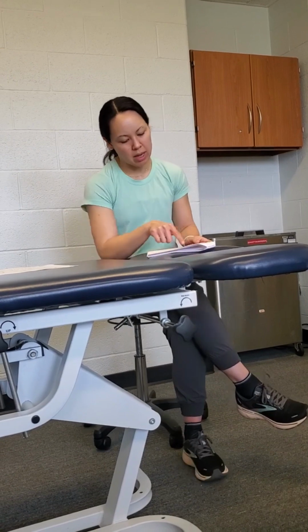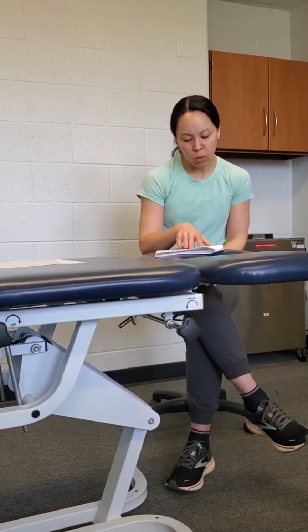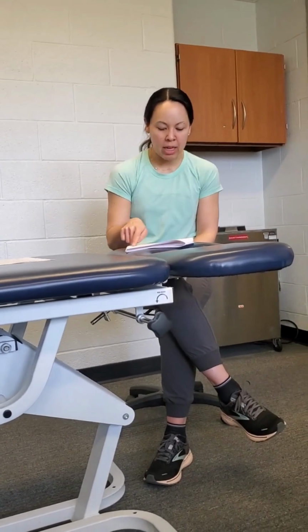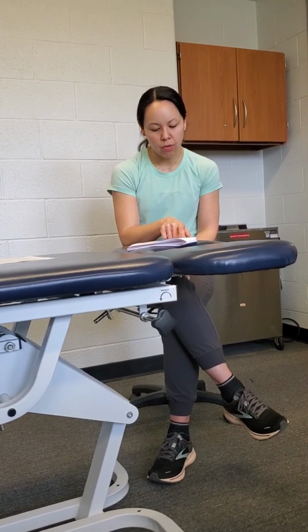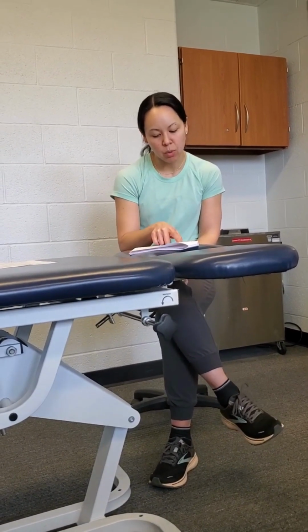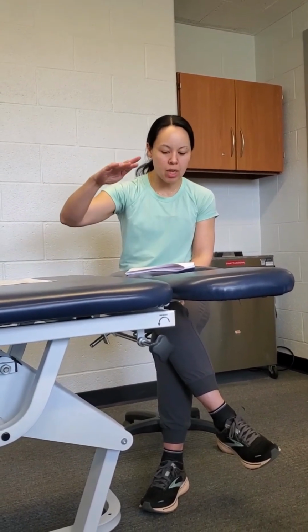For blood pressure, this article by Severin in 2020 basically takes you through the algorithm here. I wrote it out. I won't read that to you either, but I'll go over the first one. Systolic blood pressure of less than or equal to 139 and or diastolic blood pressure of less than 89. You'd want to document in the chart and inform the patient, but it's okay to do BFR. Does that make sense? So if they're below 139 over below 89, document in the chart, inform the patient, and then it's still safe to do BFR.